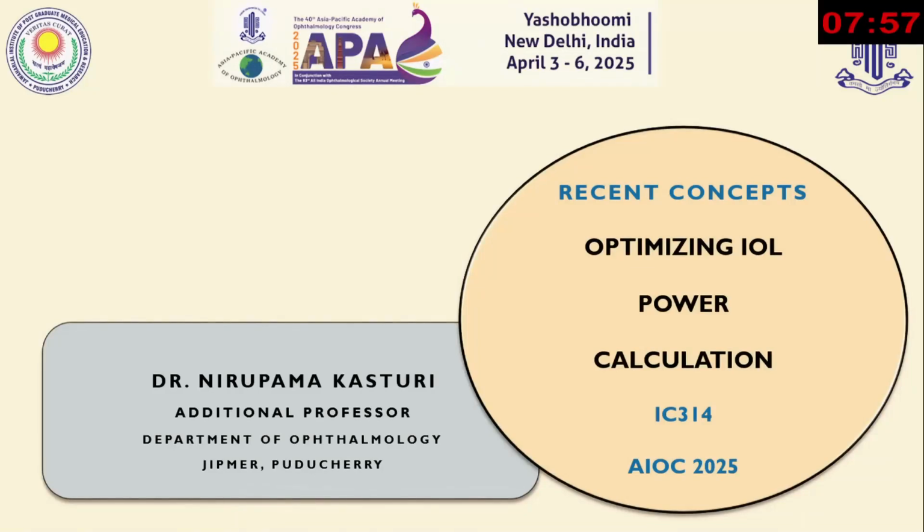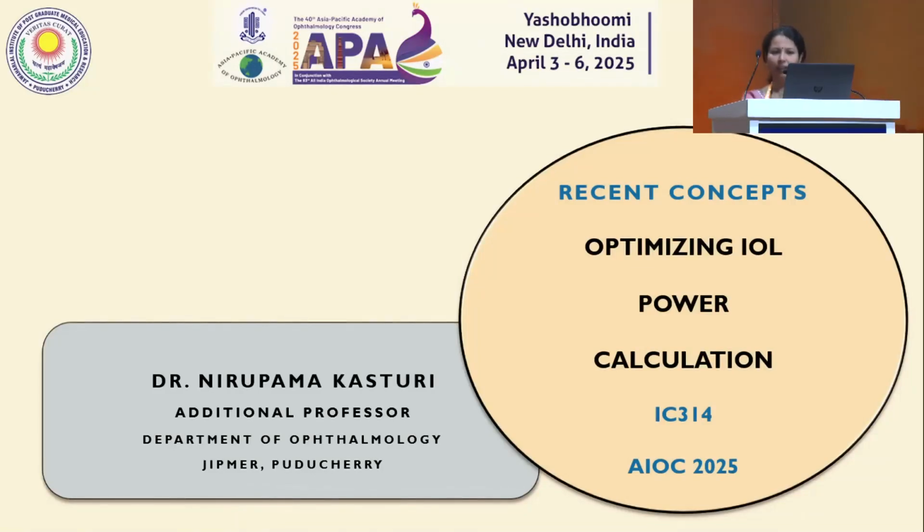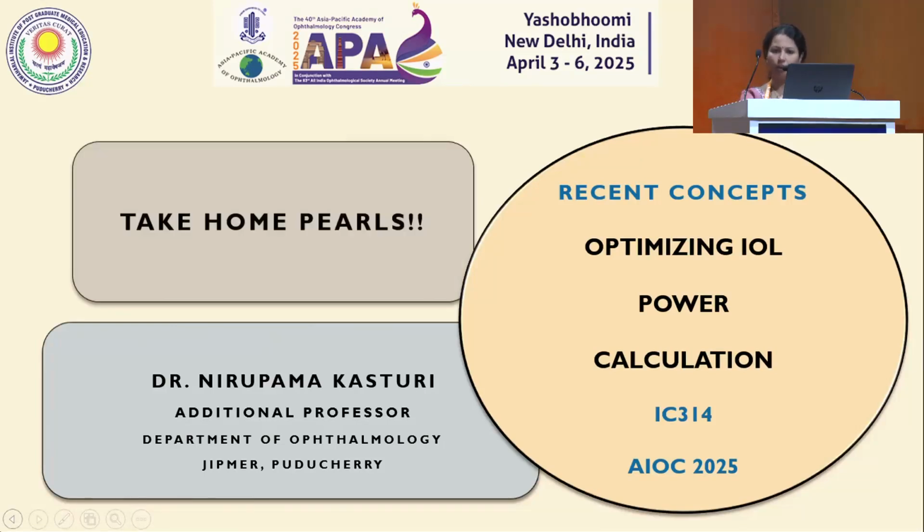As we come to an end of this instruction course, I would sum it all up and give a few take-home pearls. To optimize the IOL power calculation and reach the target refraction, we have to keep three things in mind. One is to make the biometry measurements as accurate as possible using the latest tools and technologies. Second is to use the advanced generation formulae to calculate the IOL power. And third is to give due consideration to all the special situations we discussed today, whether it's a toric IOL, post-refractive surgery eyes, post-vitreoretinal surgery eyes, or extremes of axial length like long or short eyes.